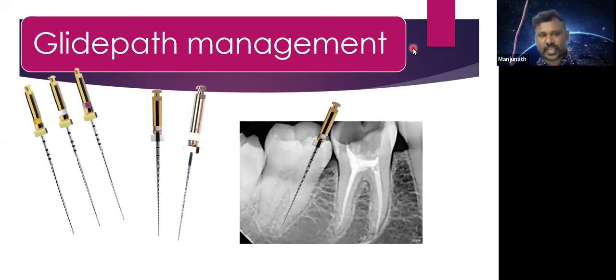அது வந்து same 2% taperலயும் வரும் or variable taper fileலயும் வரும். The size will be 10, tip diameter will be 10 or 15 around தான் இருக்கும். So இது வந்து just to have a clear glide path. நம்மளோட root canal என்ன மார்பாலஜில இருக்கோ அந்த மார்பாலஜிலே enlarge பண்ணி till the apical terminus உங்களுக்கு clear cut-ஆ கொடுத்துரும். So that you can approach till the apical terminus with the following files.